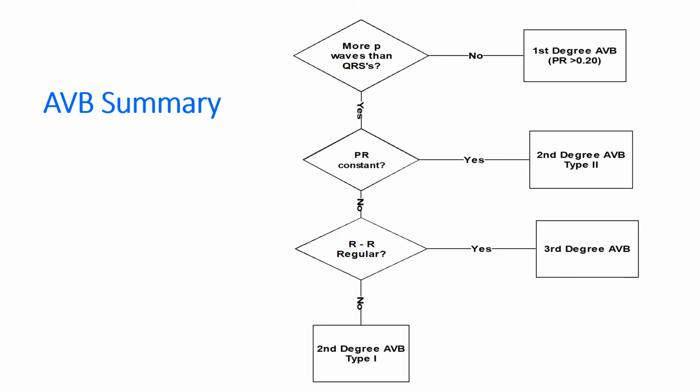And there are different ways that we are teaching you how to remember the AV blocks. It's one of the hardest rhythms that people struggle with, how to remember. So this is just a little algorithm if you want to use it. We'll show a variety of ways that you can adopt. Whichever one works for you is what you would use.